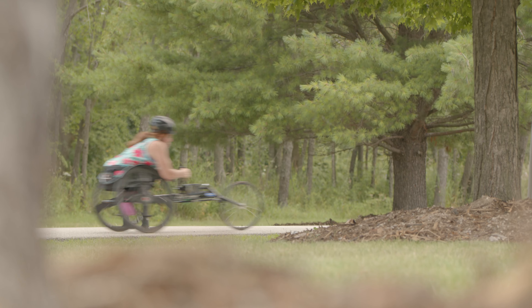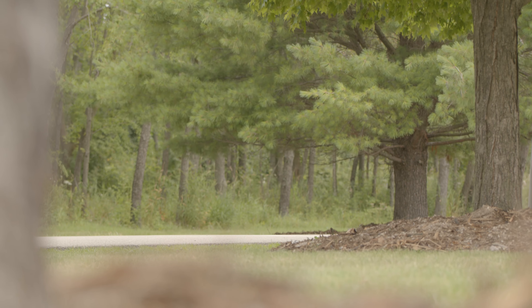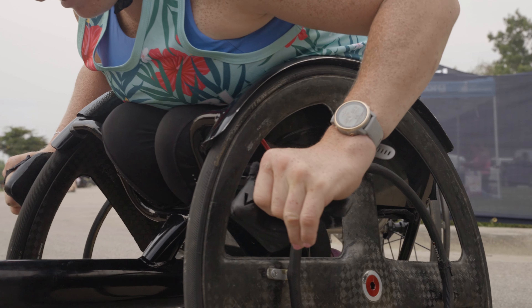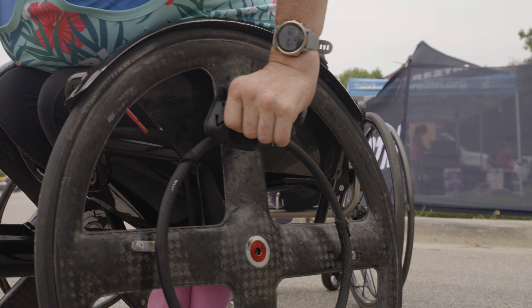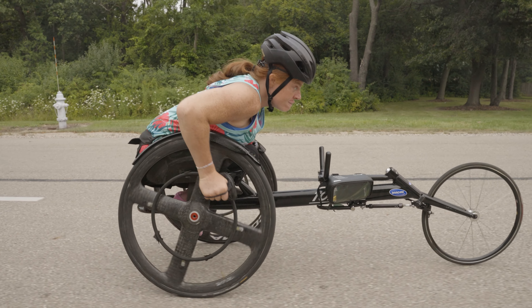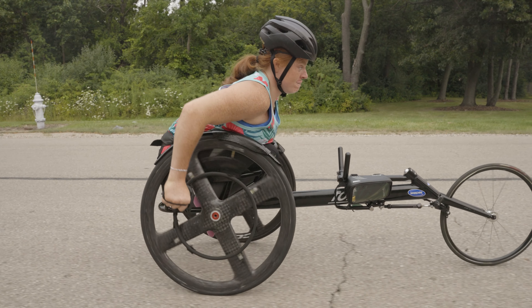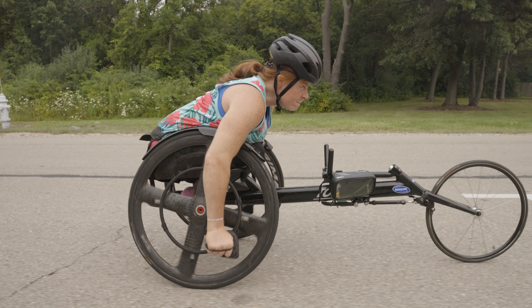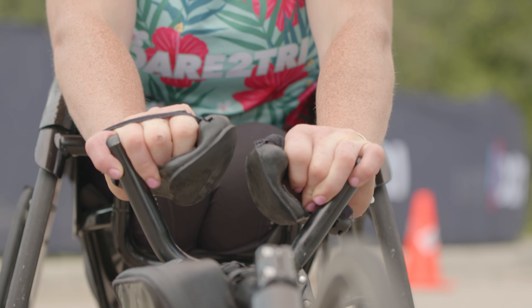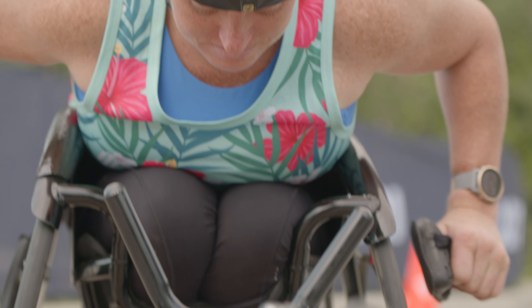When you're out on a run, here are a few things you can practice. The most common hand position is the palms-in technique, where you place your palms inward towards your body while gripping the push rims. This position allows you to engage your shoulder and back muscles, generating more power with each push. Many athletes find it beneficial to wear specialized gloves with rubberized palms to enhance their grip and prevent slippage.